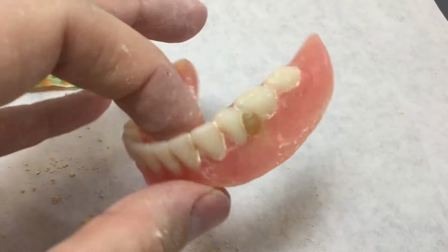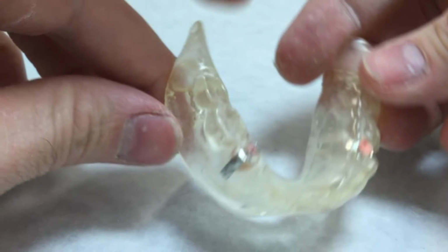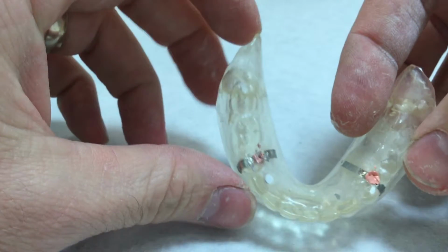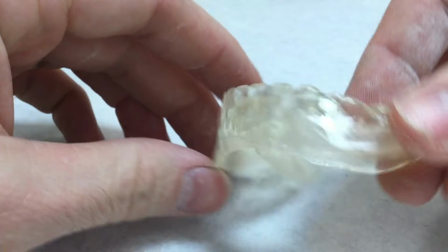If the denture tooth positioning and occlusal vertical dimension is acceptable, the current denture can be used to fabricate an edentulous radiographic guide for cone beam radiology to aid in the pre-surgical planning and to ensure implants are placed at ideal positions within the bone and at proper vertical height.